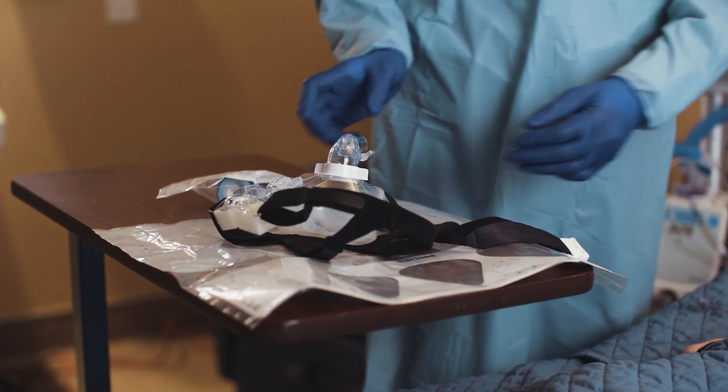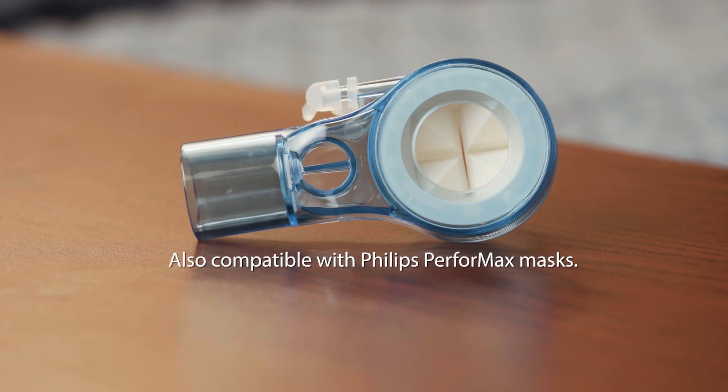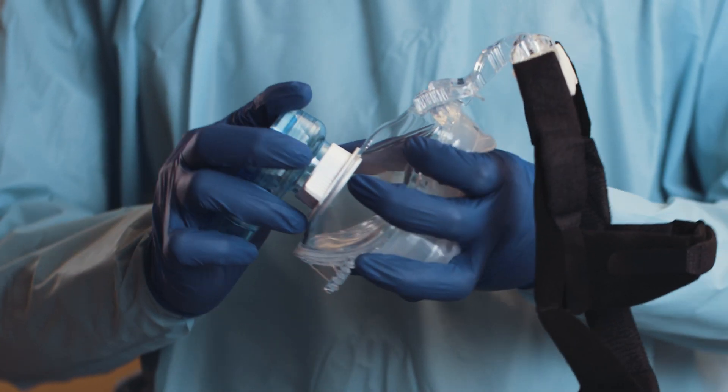Here, we're removing the existing standard elbow from a Philips AF531 mask by holding the faceplate hub and gently pulling and twisting. Now the ReadyPort 531 elbow can be attached by pressing into the mask with a slight twist while holding the faceplate hub.